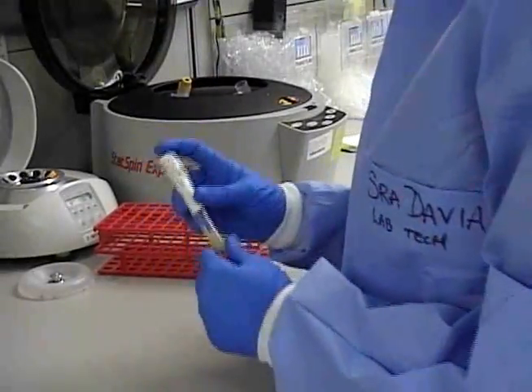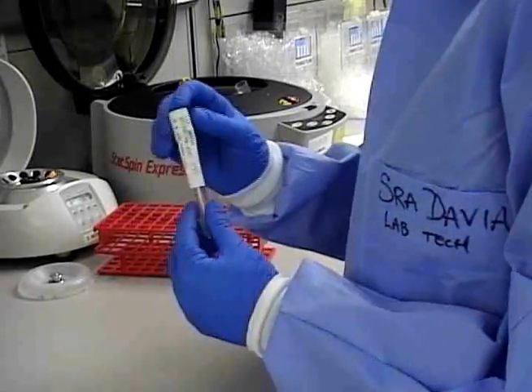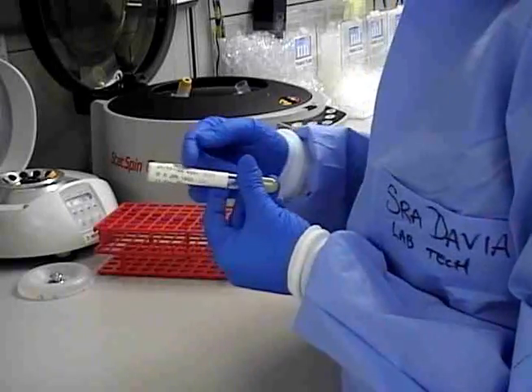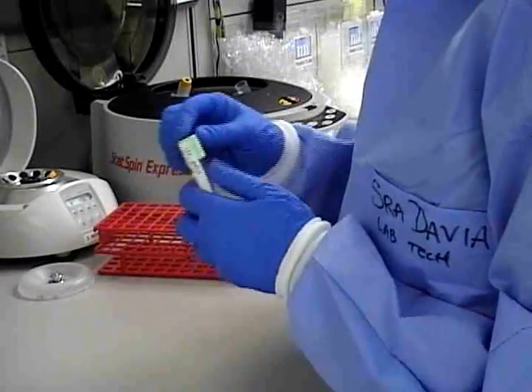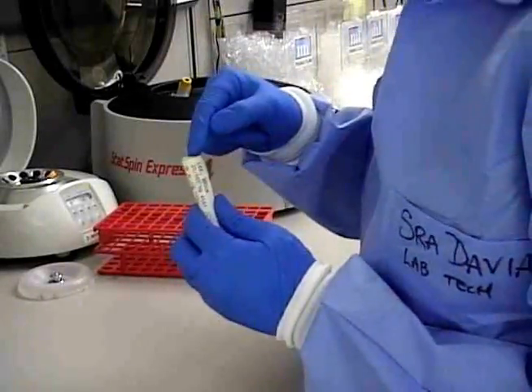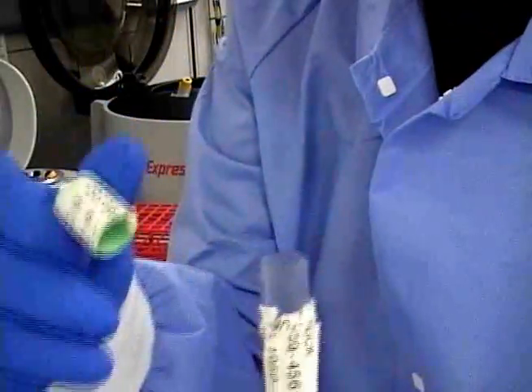Here are a few examples of the way we get incorrectly labeled tubes. This one here has the name, date, social, initials, and time, but it's labeled over the top. Now when we try and process this, we take the cap off, and look what happens. Half the label just came off.